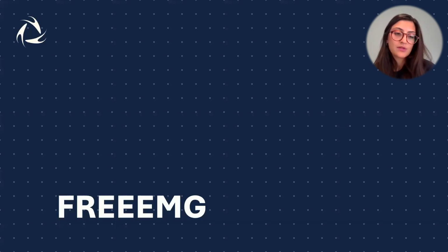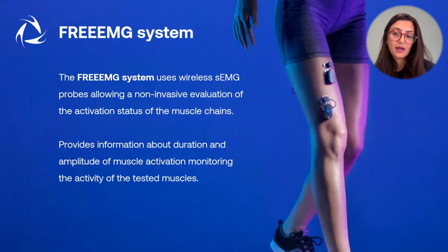So this was, let's say, the first technology. Then we move on to another one, which is the Freeemg system. The Freeemg system uses the wireless EMGs, so electromyograph probes, that allow a non-invasive evaluation of the activation status of the muscle chains. It provides information about duration and amplitude of the muscle activation, allowing also the monitoring of the activity of the tested muscles.